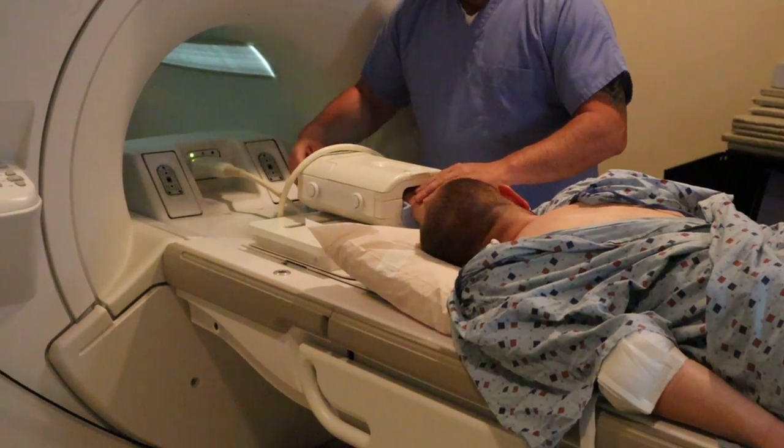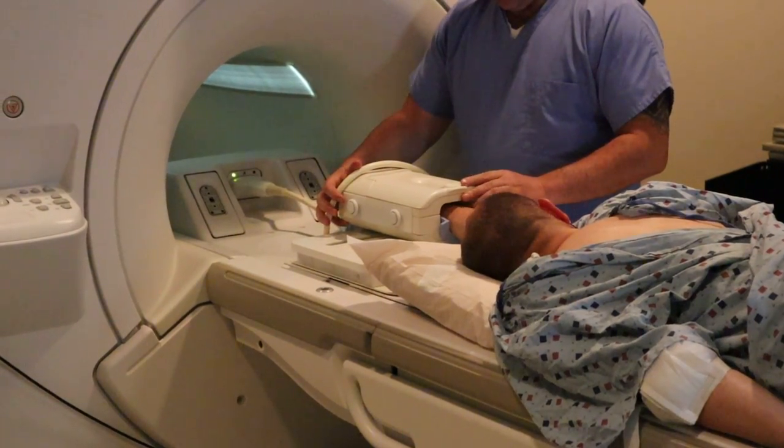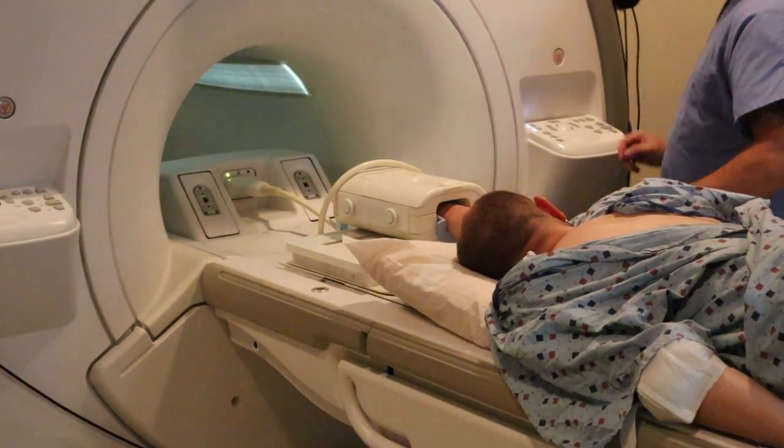With this case, there's a chance that there can be some unsteady patients because of the position. So you want to ensure that there are stabilizers inside of the coil.